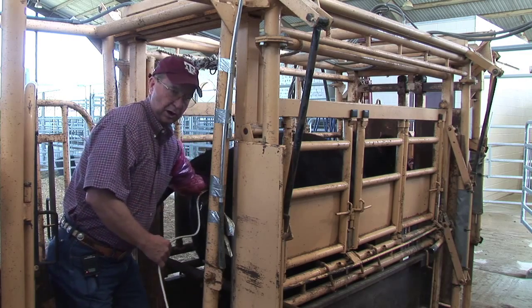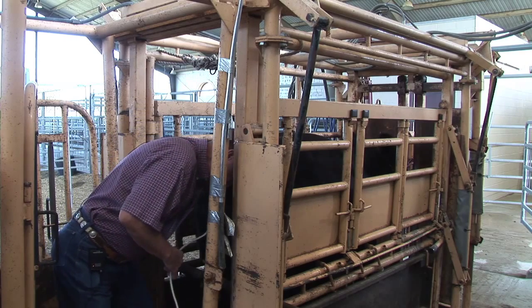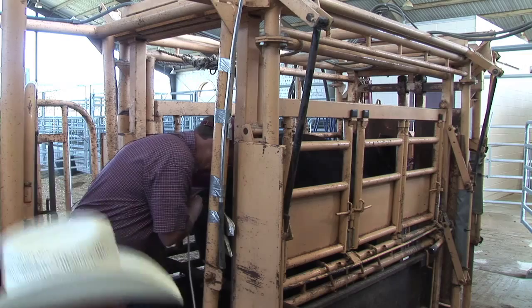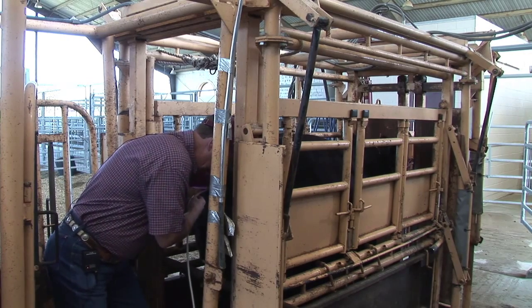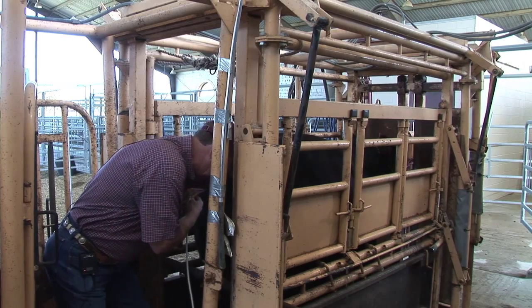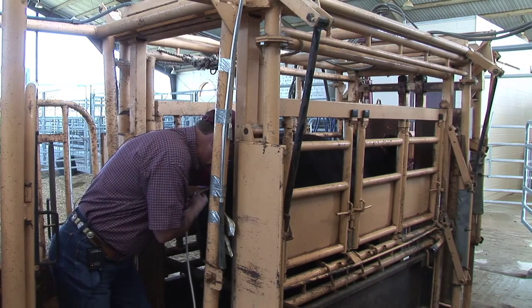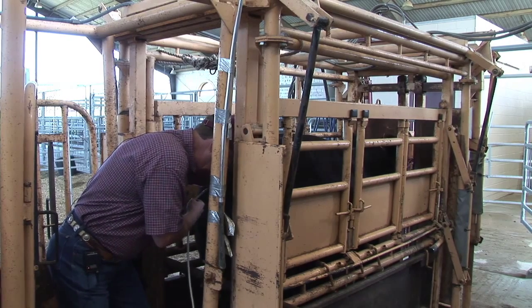you'll see a dark image on the screen. And it takes just a little bit to get everything oriented, and in your hand, you're doing two things at once. You're trying to hold the probe and you're trying to find the structure, and it takes just a little bit of manipulation to get those kinds of things done. But I'm getting pretty close to an ovary here. If I can just get it captured and brought in under the probe.